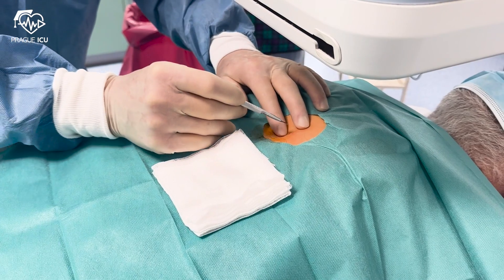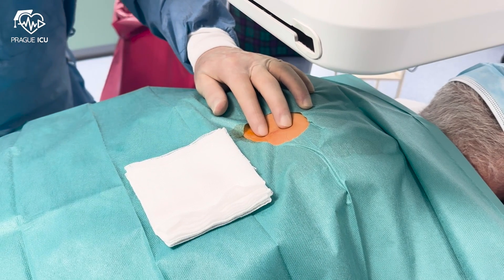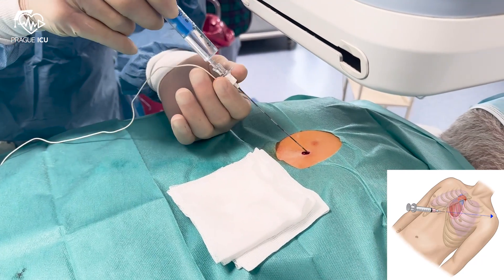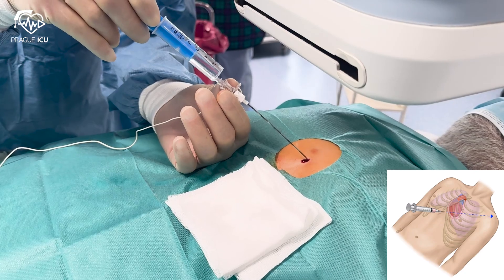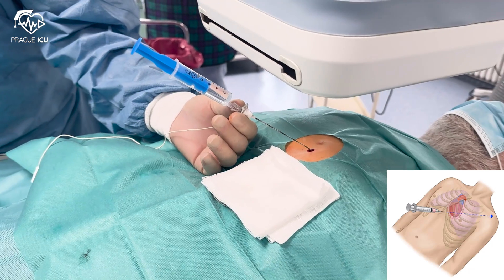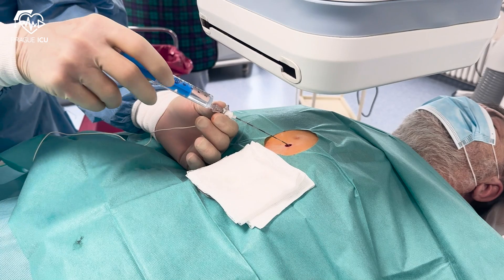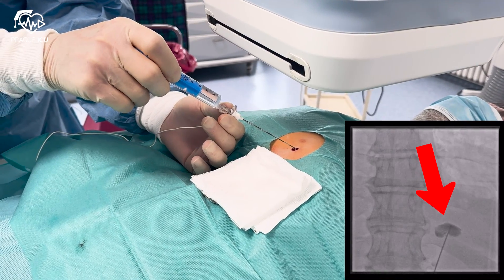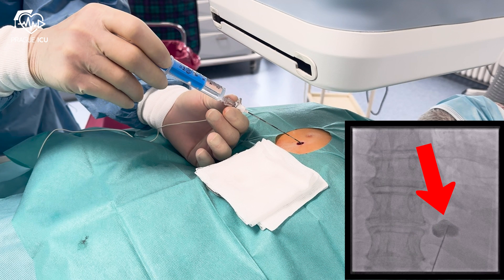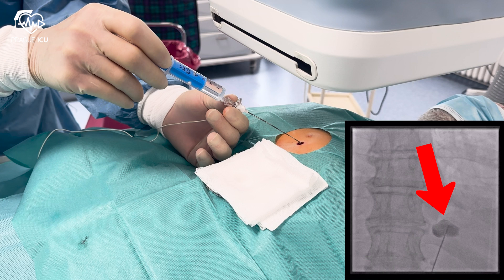A small incision is made at the entry site to facilitate the insertion of the needle and the instrumentation later on. Using the subxiphoid approach, the needle contains dilute contrast medium and is pointing towards the left shoulder at an angle of 30 to 45 degrees to the skin. Negative back pressure is applied throughout the duration of needle access. Needle position in the pericardial space is confirmed by contrast agent injection — the inferior position appearance of a sluggish layering of the contrast medium indicates the correct position.